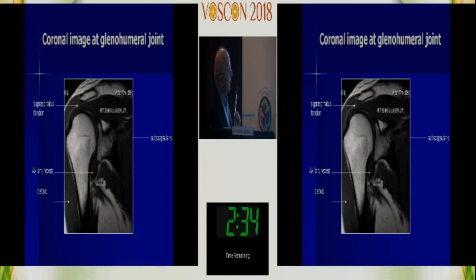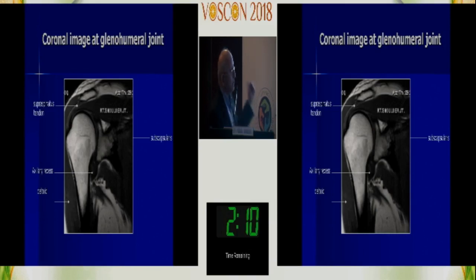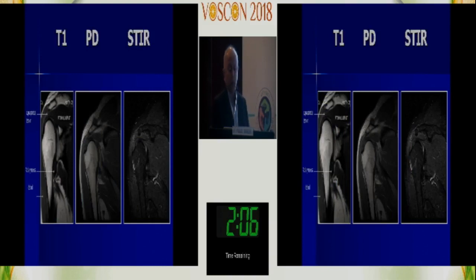Going from top to bottom on the coronal view: I look at the acromion, the ACJ, the fat below the acromion, any fluid, the cuff, the head, the glenoid, the labrum at the top, the biceps emerging, the inferior labrum, the axillary recess, and then the axillary vessels as you move down. Going out to in: the skin, deltoid, subdeltoid bursa, cuff insertion, the head, and the glenoid. With this system you don't miss pathology.